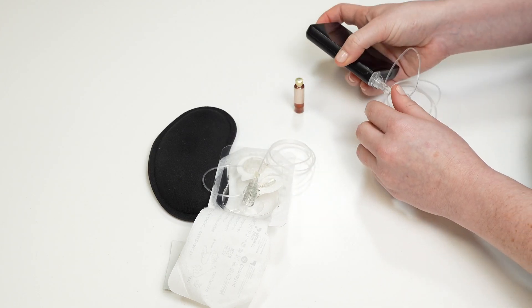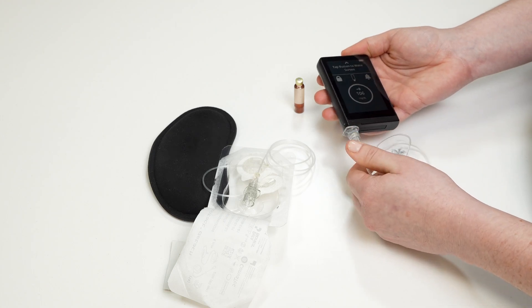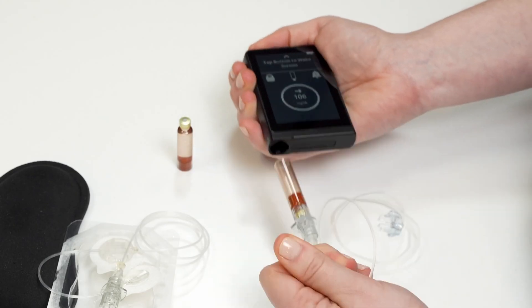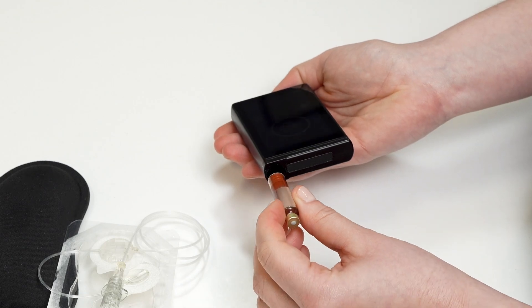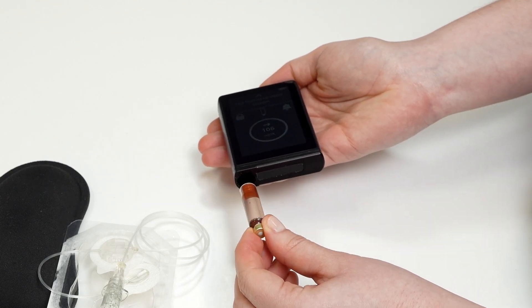Do not connect your eyelet connect to your insulin cartridge yet. Remove your old cartridge and tubing from the eyelet. Do not insert your new cartridge until your eyelet has completed the rewind process. This could damage your eyelet and insulin cartridge, as well as accidentally push insulin through the tubing.